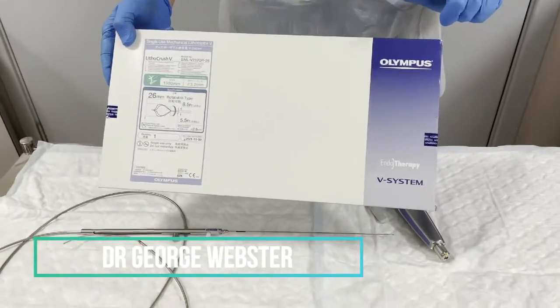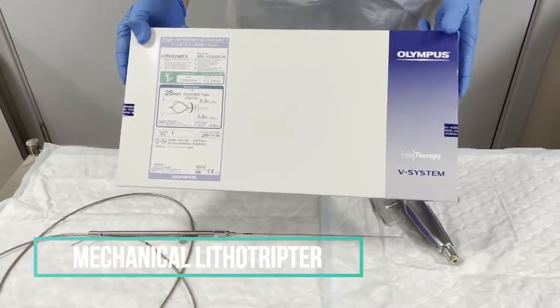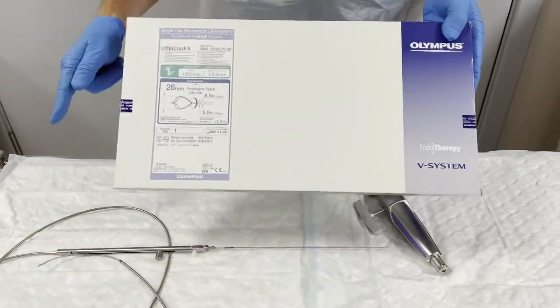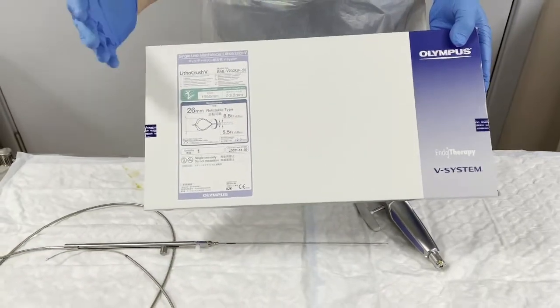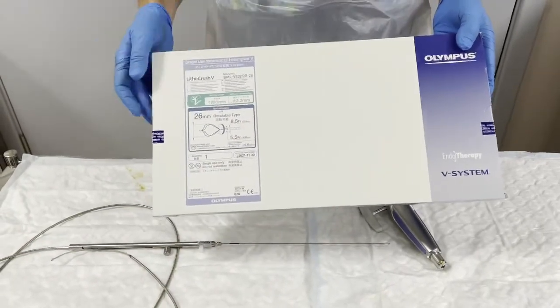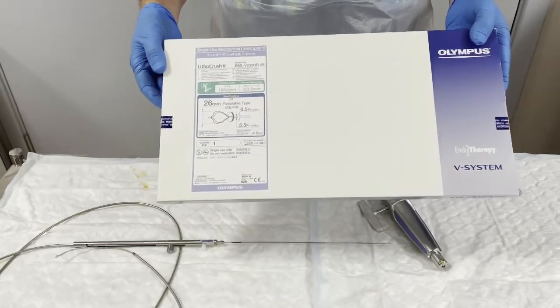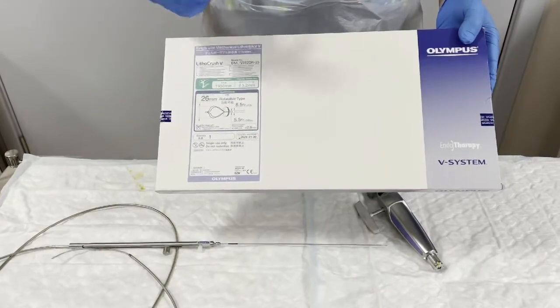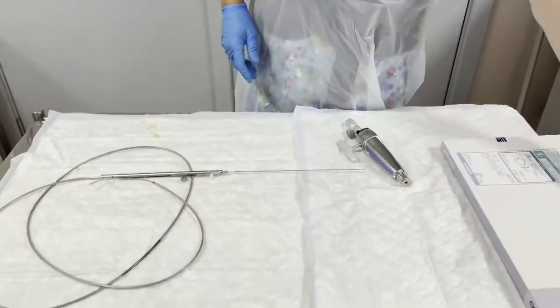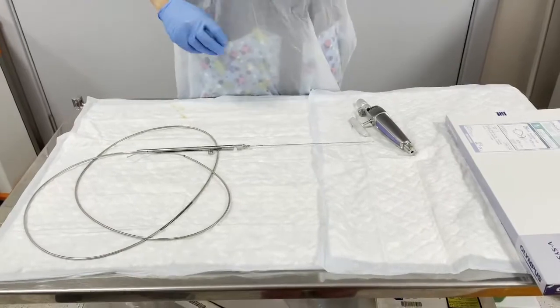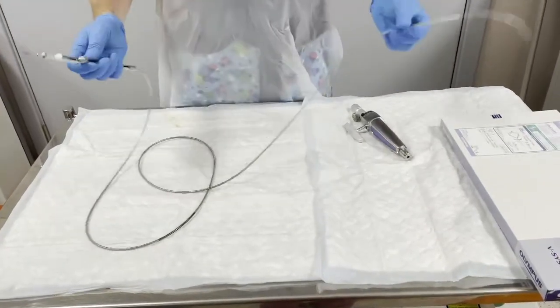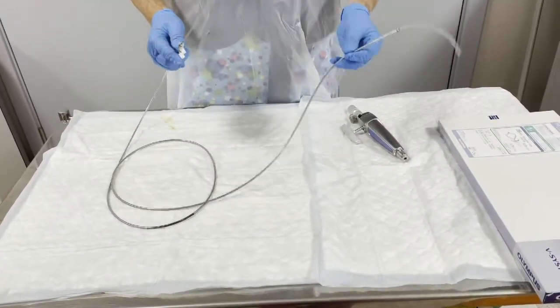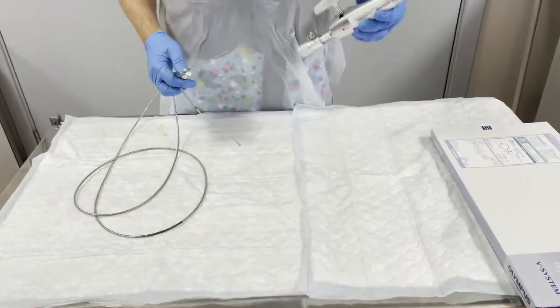Okay, just going to show you very briefly how to use the mechanical lithotriptor. We use the Olympus Lithocrush V. There are different versions that need to be assembled in very different ways, so I'm just going to show you some of the absolute fundamentals of this. This is the mechanical lithotriptor, and this is single-use, and the handle is multi-use, also made by Olympus.